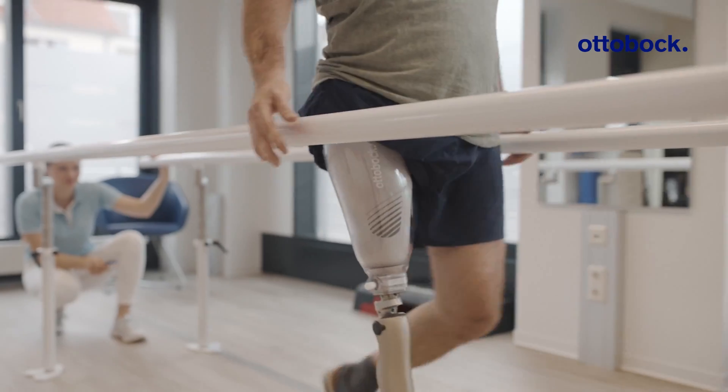Compared to Gips, compared to a plaster cast, my fitting today with MyFitTF was very pleasant and also quite fast.